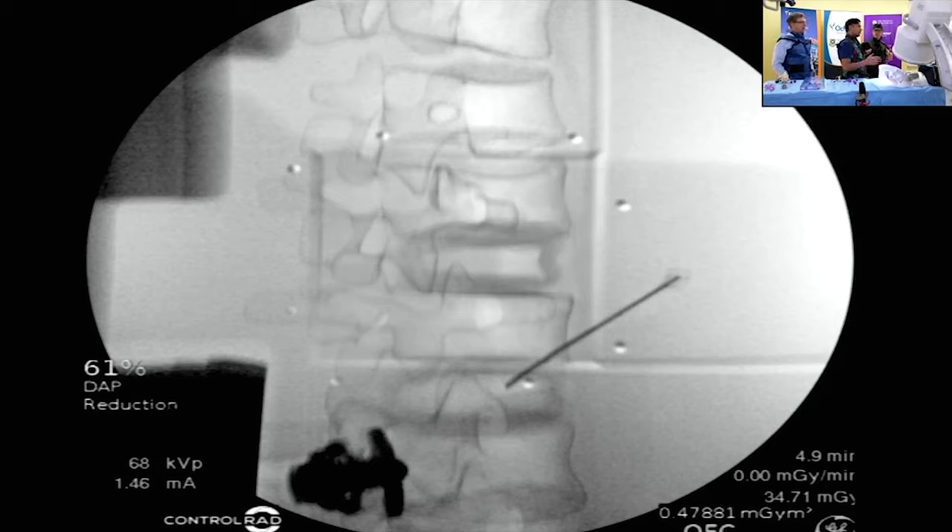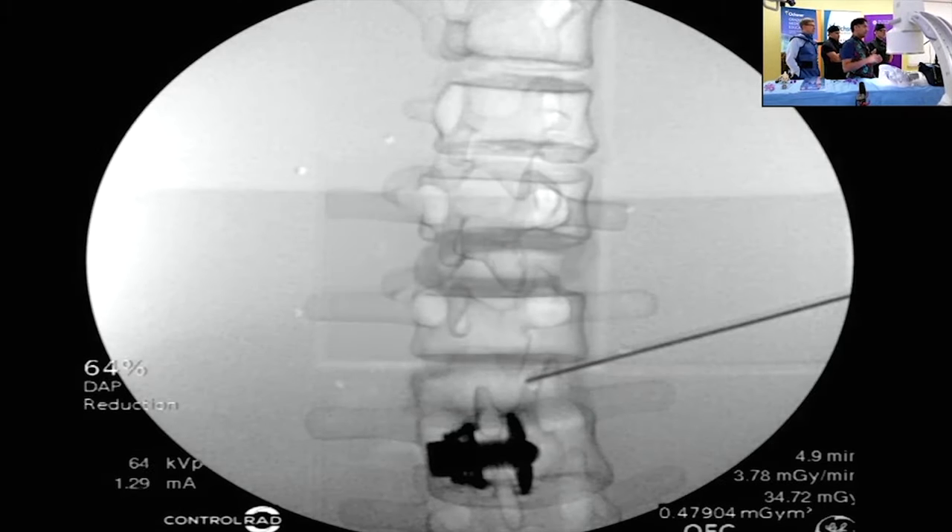Following Kambin's triangle approach, we're trying to enter close to the SAP, low in the foramen. Once we've seen the approach of the needle on oblique view, you're going to bullseye that view, then go back to AP and check to make sure you haven't gone too far — just like in kyphoplasty, you're always checking to see that you haven't passed the medial border of the pedicle.